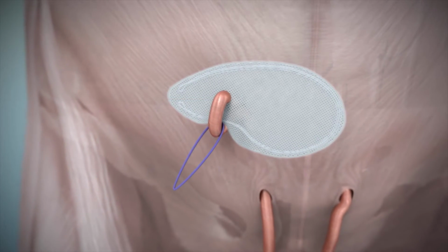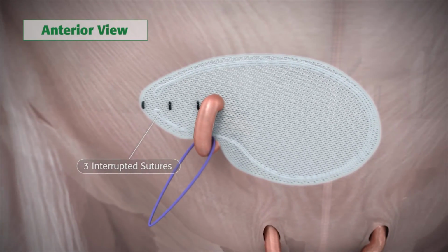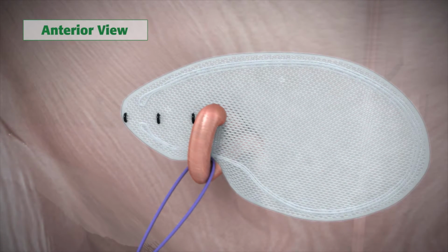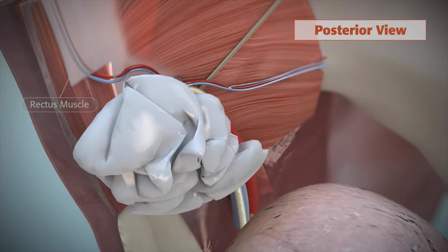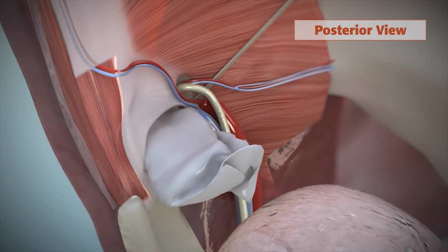Place 3 non-absorbable interrupted sutures into the hernia patch to join the prosthetic tails together. Please note, this technique is tension-free, and no sutures are placed into the tissues to fixate the Polysoft hernia patch. Remove the sterile gauze from the operating site and return to the scrub nurse.